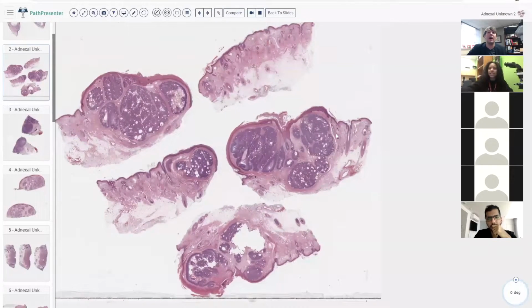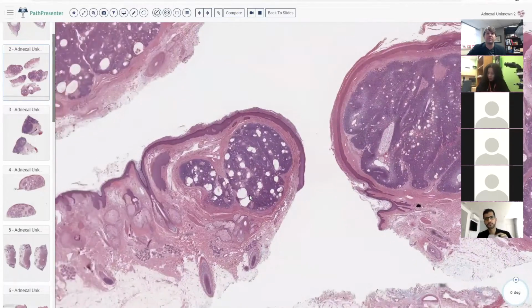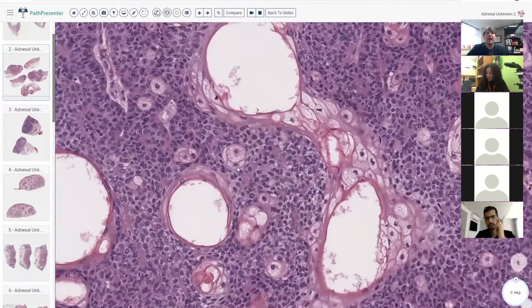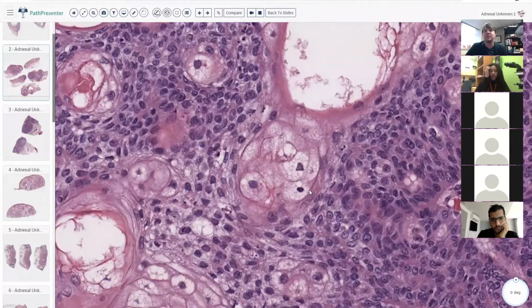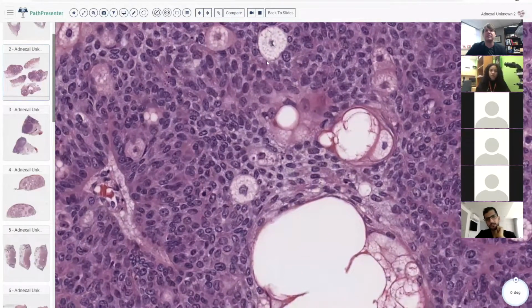All right, this is another lobular tumor, pretty well circumscribed, but it's much more blue, right? It's solid blue lobules in the dermis. Also has some cystic spaces in it. And when we get closer here, we can again see sebocytes. Very nice, vacuolated. The vacuoles are a little more fine and delicate in this case, but you can definitely see nice, obvious sebocytes in here.